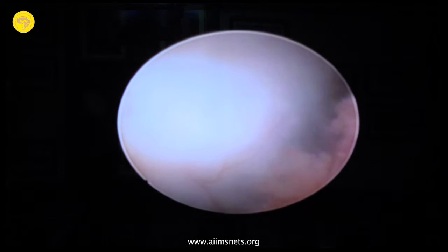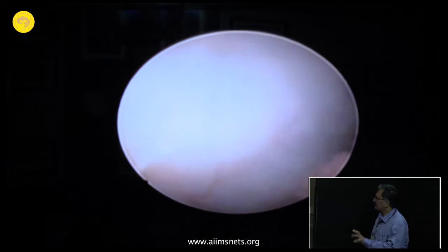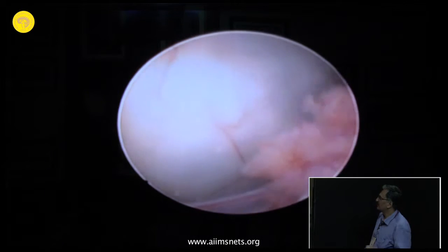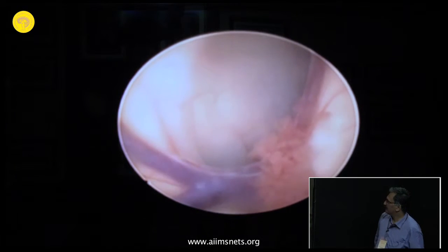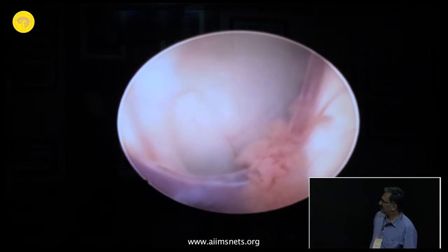Okay, fine. This was a very thick membrane. It couldn't just be taken off. So here, sometimes you may need a monopolar or something. You can decompress. And you see the beautiful anatomy here, just like a copybook picture.